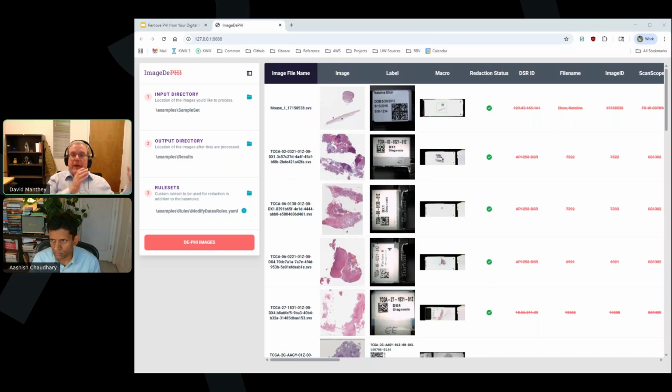We validate things with tools like OpenSlide. We have our own library, Large Image, which can read hundreds of formats, and OpenSlide is one of the readers for that. But we actually don't decompress these. We are literally using libTIFF, the very one that I said the TIFF set worked poorly on, to read the actual portion of the image from a TIFF, using pydicom for reading a portion of the DICOM, and then libJPEG and OpenJPEG to read various encodings in that.